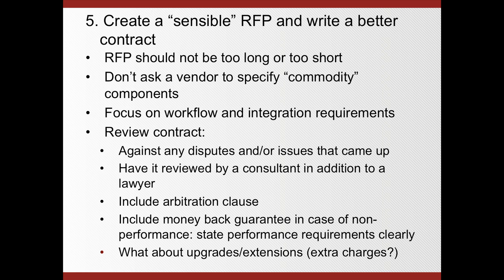So focus definitely on the workflow and integration requirements. Describe how your institution currently operates, and how the physicians and the users and the technologists like to use the system and how they use it today, if they use it today. One of the issues that quite often occurs is when an existing workflow has to be replaced with a different workflow, and particularly if that different workflow is not necessarily as efficient, we want to make sure that you don't come into that situation. So focus with your RFP on workflow and integration requirements.